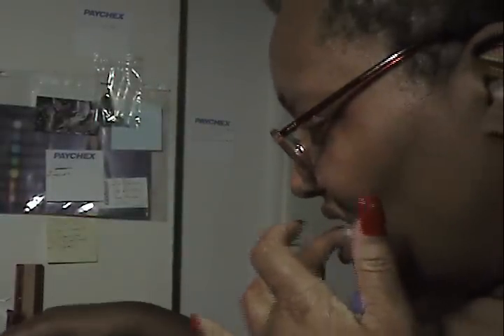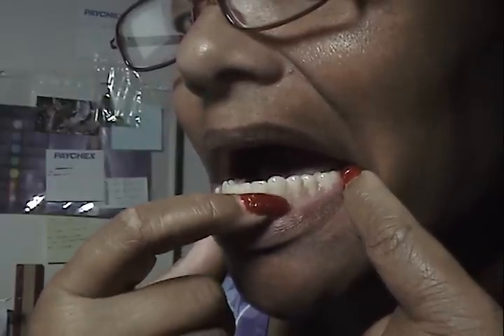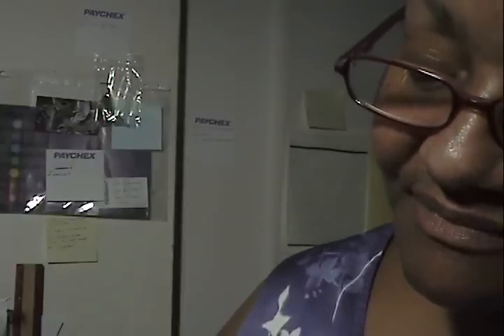Now. Where's my water? Okay, let me rinse off my bottom, as it were. Thank God I got my little plastic liner here. See how that feels. See, and then now, after I finish doing the inside, damn, I gotta do right there. Let me see. Right by the eye tooth. I gotta zip a little bit of that off.